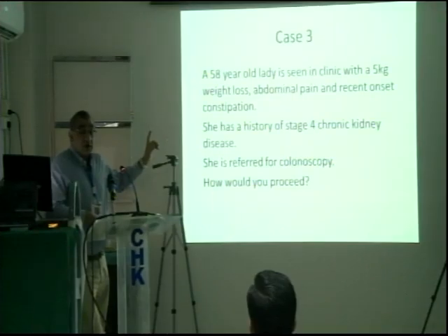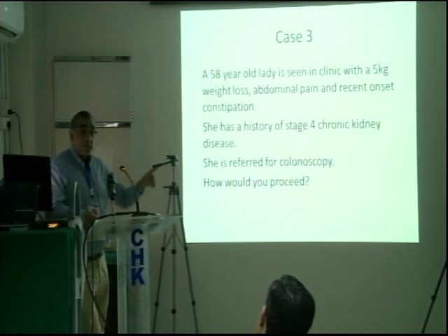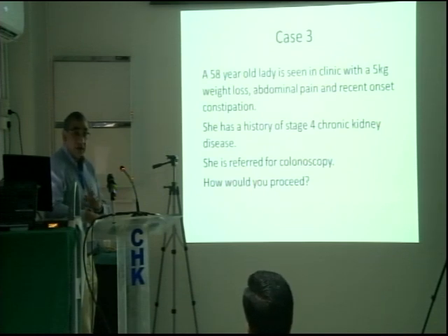The type of perforation you get in the scenario the doctor is describing is terrible, because either the whole perforation happens, meaning a rip, or the whole sigmoid mesocolon is ripped and you get massive hemorrhage from that. So that is very important: under GA only a very good colonoscopist should do it.